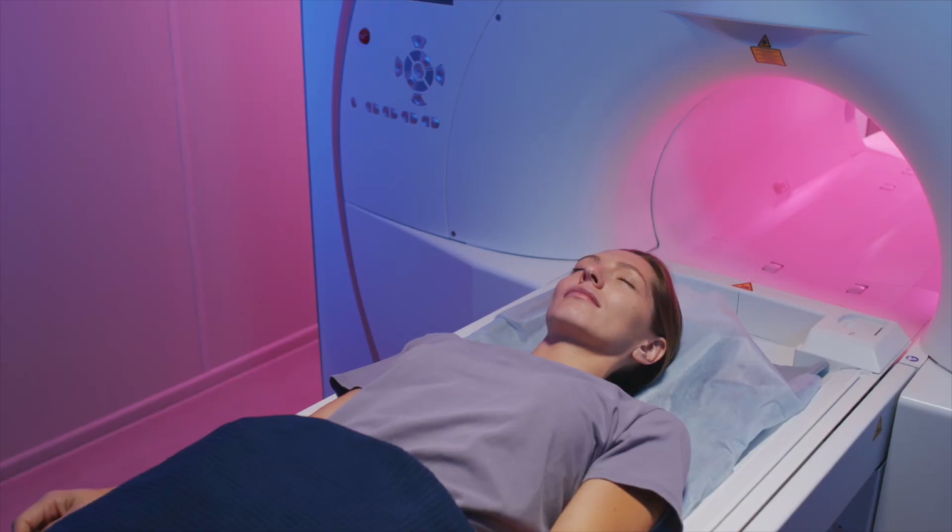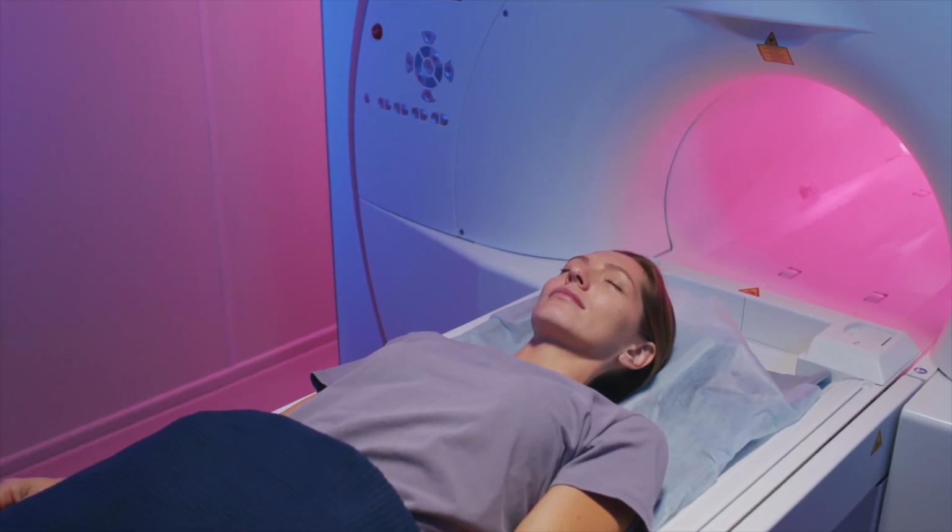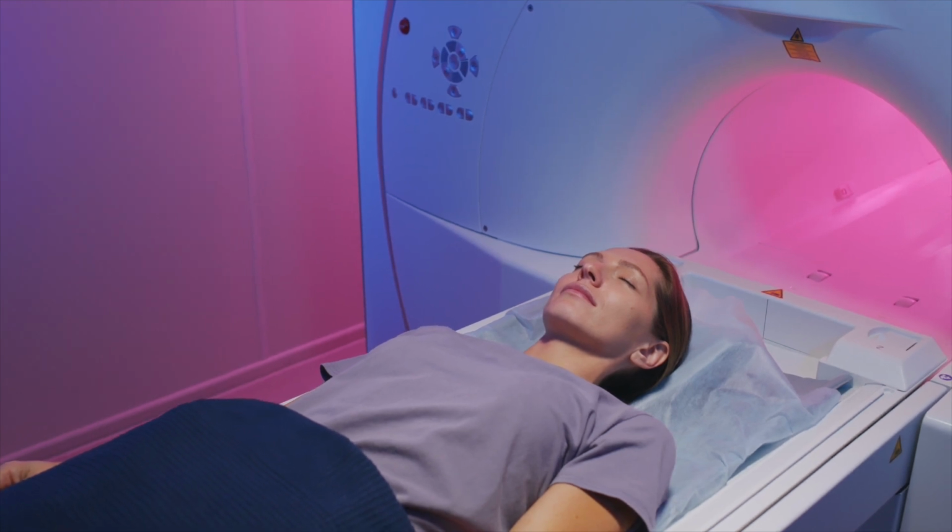Now, the process for an MRI can be kind of, let's say, taxing, right? The MRI is effectively a big magnet. MRI stands for magnetic resonance imaging, and basically it's using a magnet to get a picture or representation of that knee. And so when you get an MRI, you're going inside what looks like a small tube, right? It's a big machine with a small tube that you slide inside as the patient. And while you're in there, that magnet is running and it's loud, loud.